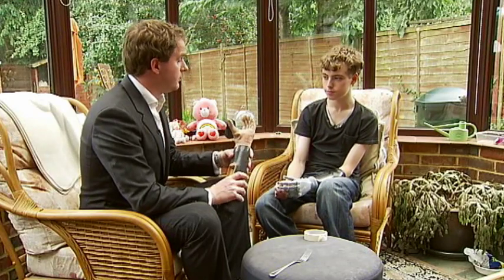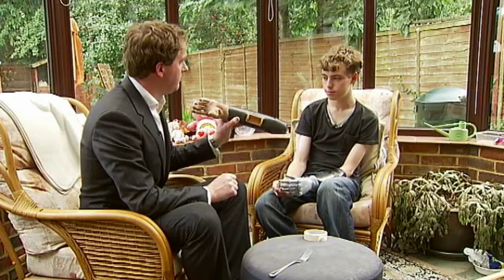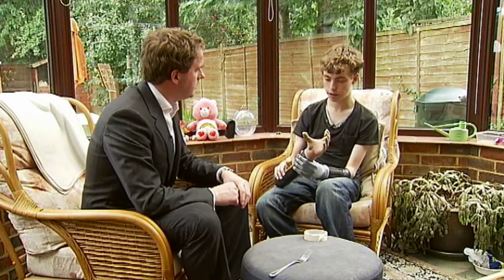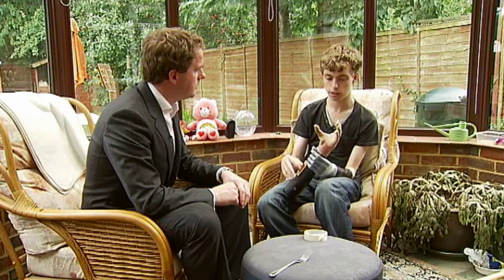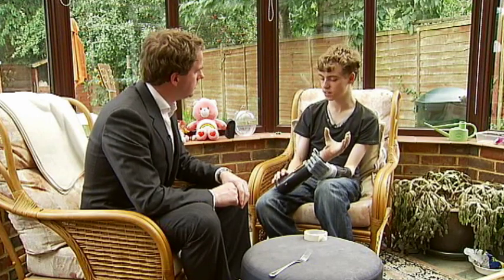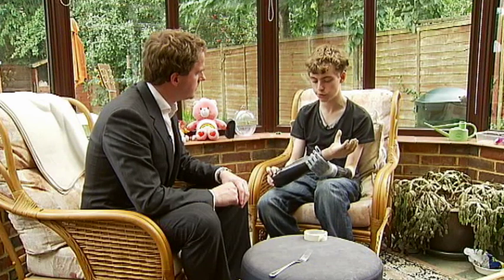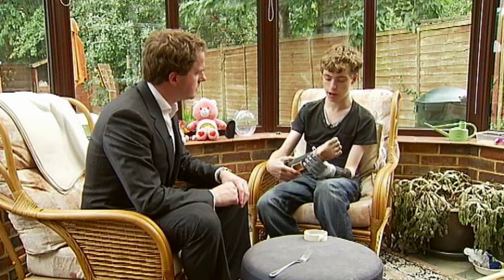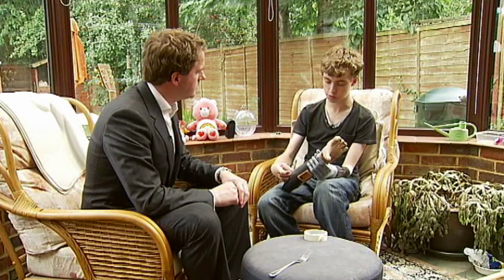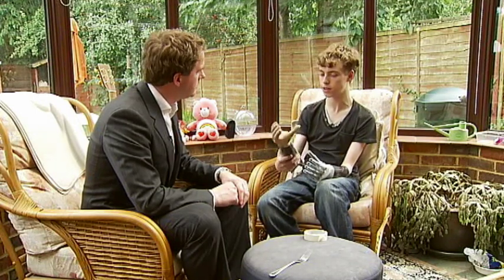So Matthew, this is the hand you had for a few years, I imagine beforehand. How is this different to what you've got now? Well, underneath this it's just simply a claw, almost a metal tripod. And it can only really do a few mundane tasks. It's not particularly useful. When I last used it, it wasn't the perfect fit. The electrodes were a bit dodgy, so it's essentially just dead weight.